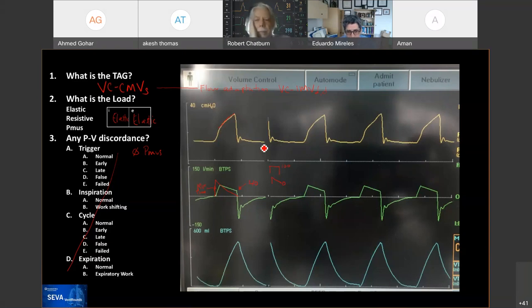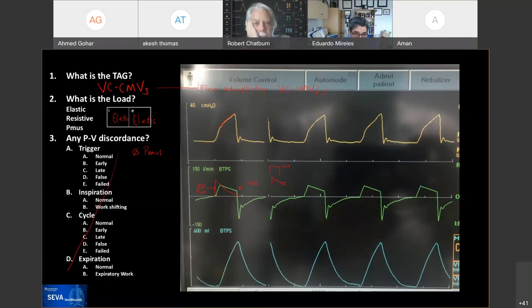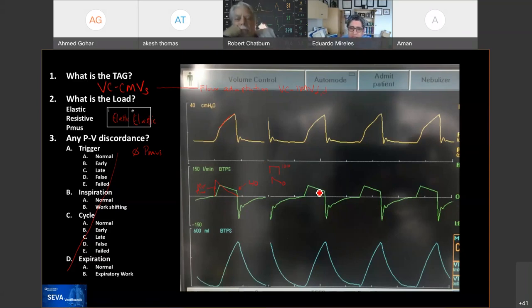Amit comments: he was going to comment on stress index, but realized this is a descending ramp, so that comment doesn't apply — you need constant flow to assess stress index. Eduardo agrees, noting a recent case where the patient was paralyzed and the inspiratory time was very short at 0.5 seconds with a square waveform. The stress index looked like the patient had recruitment during the breath. When the inspiratory time was extended for the same tidal volume, the flow waveform became clearer, the pressure waveform changed, and the stress index normalized to 1.0 — a perfectly square waveform. Ventilator settings can create waveform changes that affect how you read physiology.